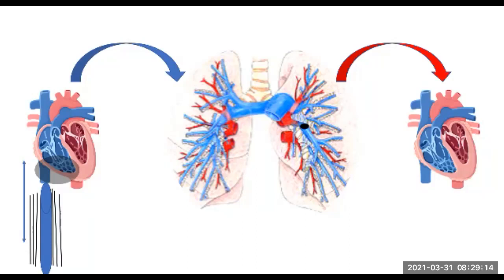So let's just jump a little bit forward. So you've got this atrium and this ventricle that are trying to pump blood through this lung, all right? Now, there's a big backlog. Everybody's been in a traffic jam. It's a whole lot of cars before the traffic jam. And then as soon as you get past the traffic jam, how many cars are there? Do you still have that same amount of cars? No. All of a sudden, there's like 1 car, 2 cars, and they can just carry on, right? Let's say there's an accident on a highway or something like that. As soon as you pass the accident scene, the thing just opens up and everybody can just go flying, but in smaller numbers. Okay, so how much blood is getting delivered to the left atrium, number one, compared to normal?